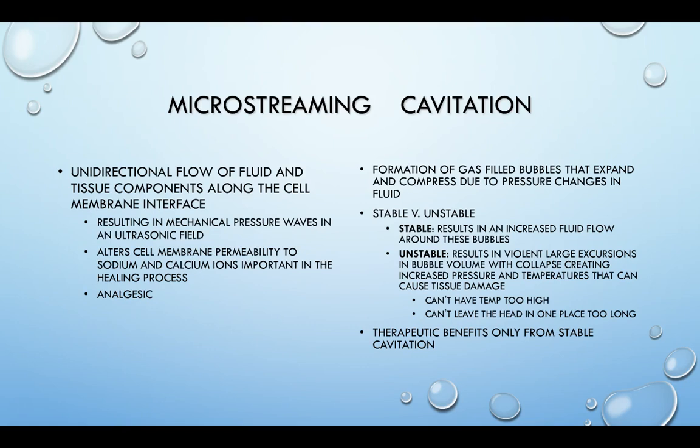Unstable cavitation is when we have too much of this energy too quickly. Maybe it's because of standing waves. Maybe it's because we're not moving. So this would be the third reason that we would keep the ultrasound head moving, is to try to not produce unstable cavitation.